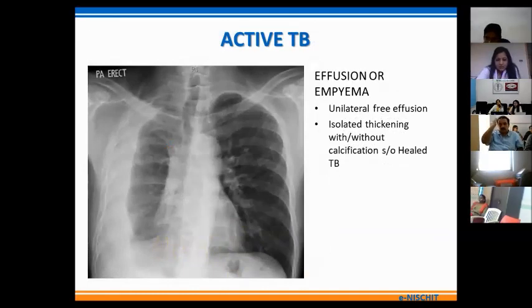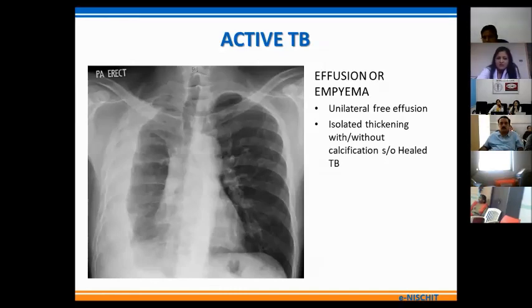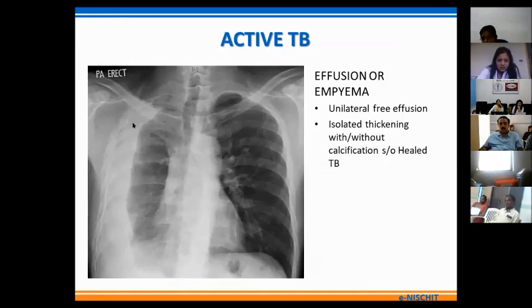This X-ray demonstrates a common finding of active TB — the presence of effusion or empyema. It could be a large effusion as in primary TB or a small loculated empyema as generally seen in the post-primary form. The pleural effusion can also present with pleural thickening, which may calcify in due course of time as a marker for healed TB. This X-ray shows effusion with some non-homogeneous opacities in the surrounding lung field.